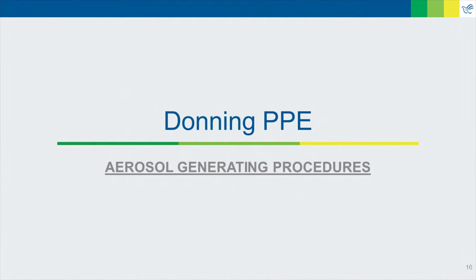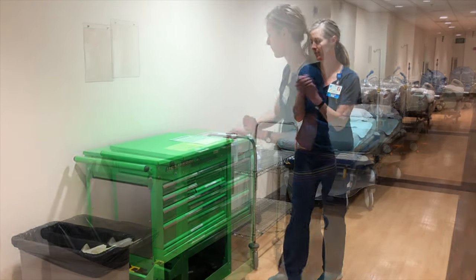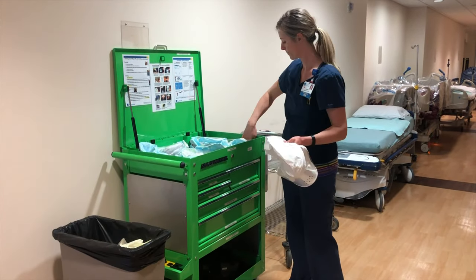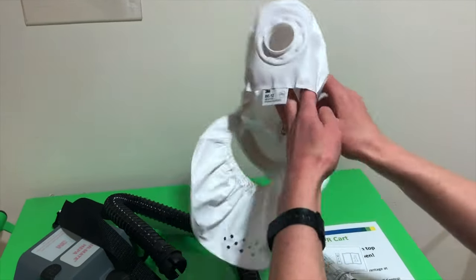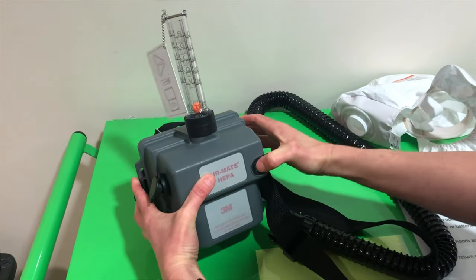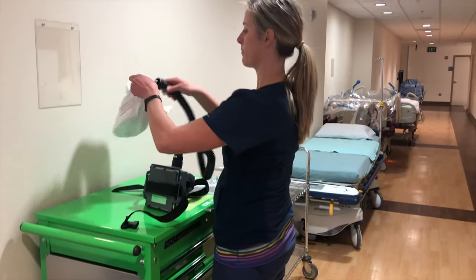Now we'll go through a demonstration of donning and doffing PPE when we need to use a PAPR for aerosol generating procedures. Just like before, we'll start off with hand hygiene. Next, we need to check the PAPR and the PAPR hood to make sure they're safe to use. Inspect the PAPR hood for any rips, tears, or cracks in the face shield. Verify that the unit has a charged battery and is producing enough airflow to keep you safe. When using a 3M tester, make sure that the orange ball rises above the letter I when held in a vertical position. Reconnect your hoses, ensuring they snap into place.